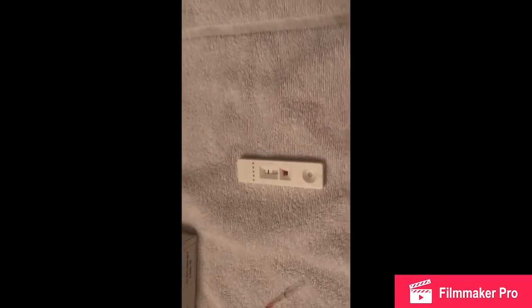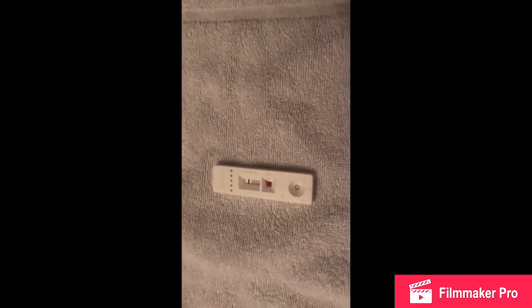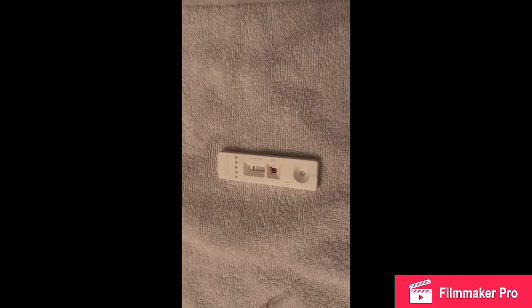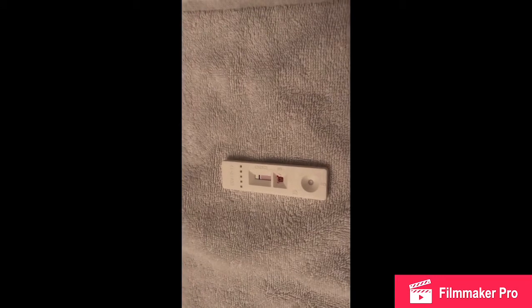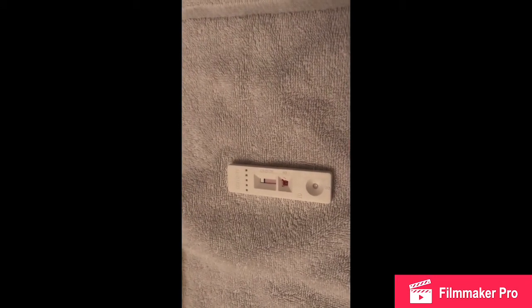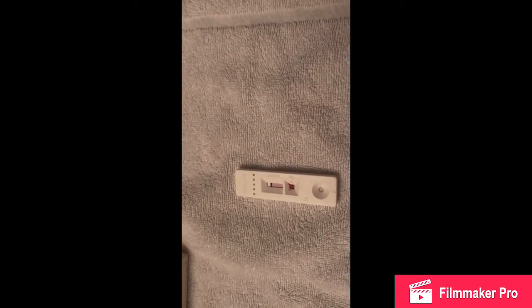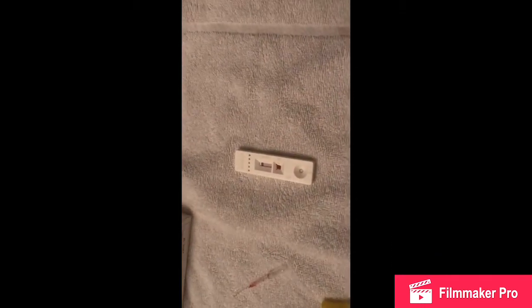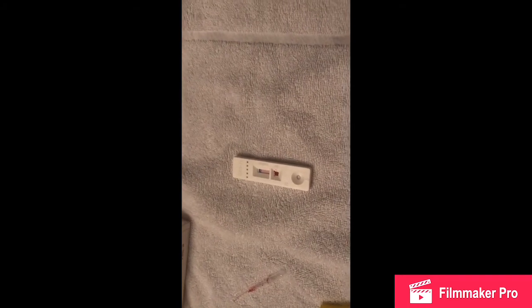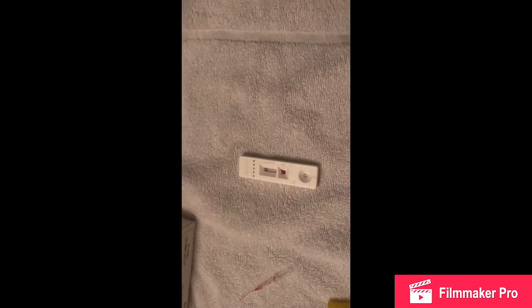Now I think we just wait for the results for 10 minutes. Once the 10 minutes is over, we will get the results. I think two lines is positive and one line is negative. We will have a look at the booklet again just to make sure we know what the results mean, and we'll come back to you in a little while.